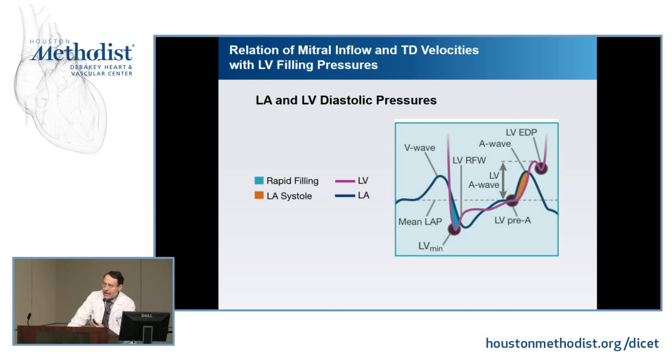Echocardiography and any modality that seeks to assess diastolic function would like, or ideally should be able to give you, information about different pieces, relaxation, stiffness, in addition to pressures. But the part that is most reliable is the pressures piece. Though in some situations saying that the ventricle has abnormal relaxation is straightforward, for example, in a heart with depressed ejection fraction. So what are the pressures that can be measured in the ventricle?